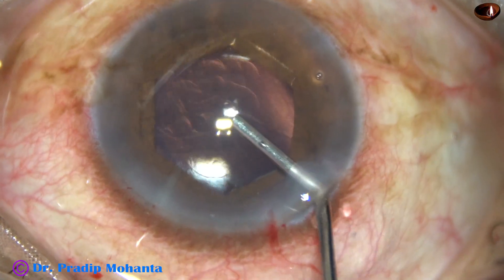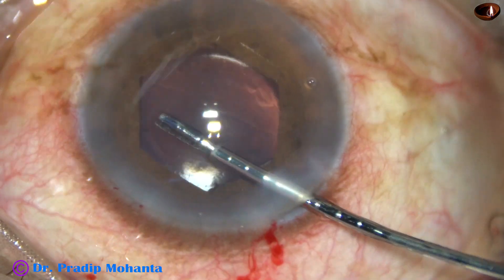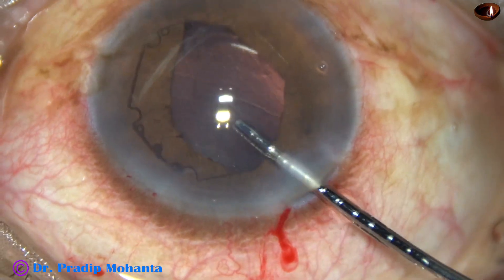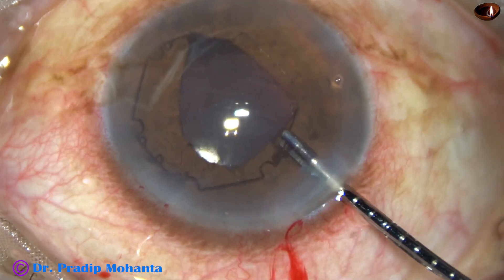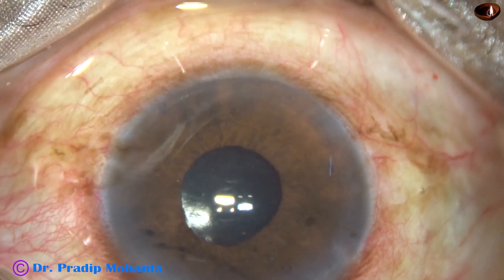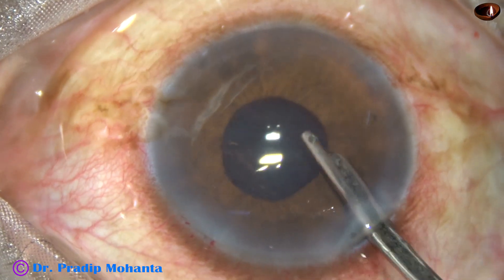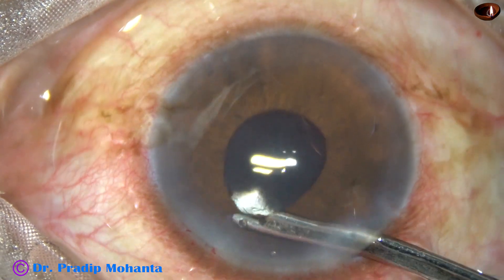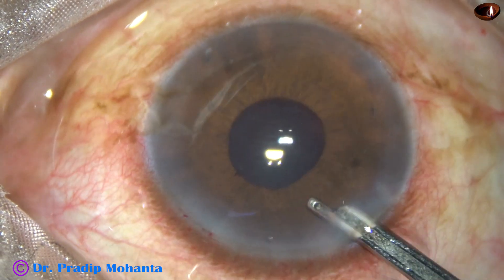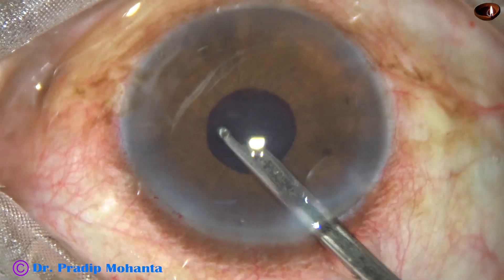And a similar gap should be maintained between the cornea and the faco tip. Now this is how we remove the B-hex — after injecting visco, untuck all the flanges and just pull it out. So this B-hex is a very beautiful device. In my opinion, it is much easier than any other device to apply and to remove — removal is much easier.